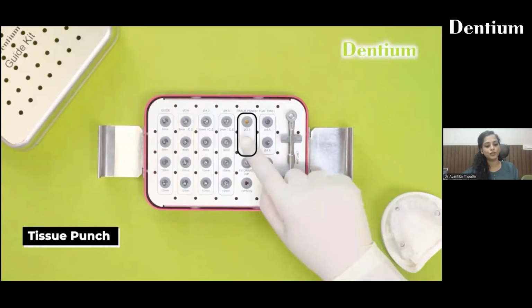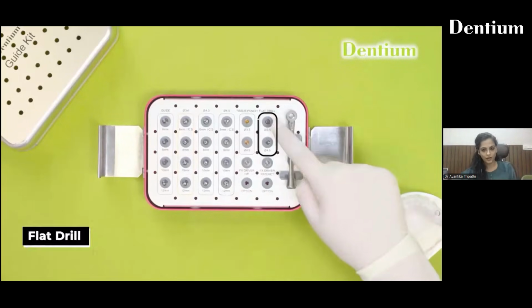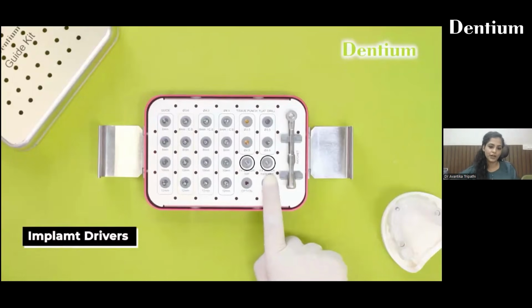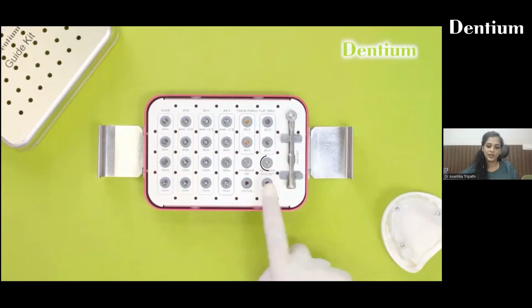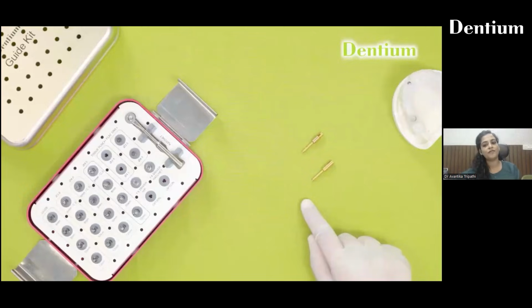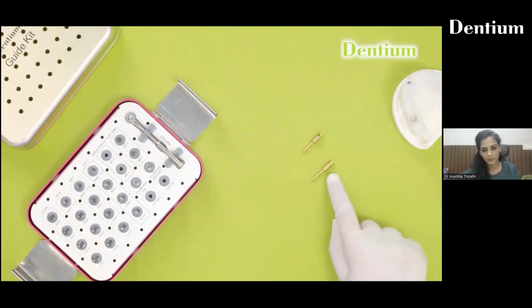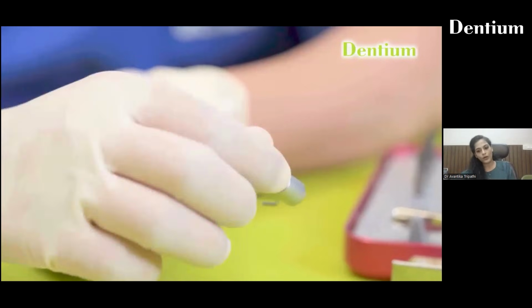There are 2 tissue punches available in the diameter of 3.5 and 4.5. Two flat drills are there with a diameter of 3.5 and 4.5. As I showed you, there are two types of implant drivers. One is ratchet driven and one is handpiece driven, and this is the ratchet. Basically, a tissue punch of 3.5 mm is used in cases where I need to place an implant of 3.6 mm diameter, and a 4.5 mm tissue punch is used in cases where I need to place an implant of 4 or 4.5 mm diameter.